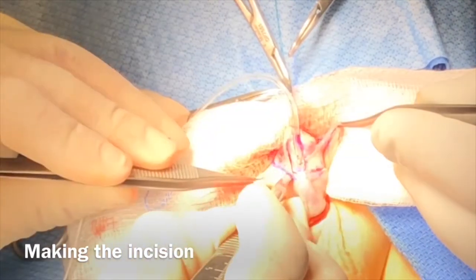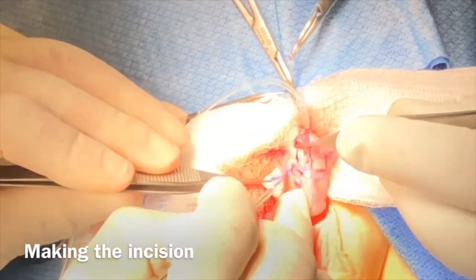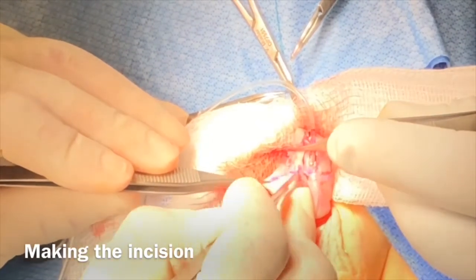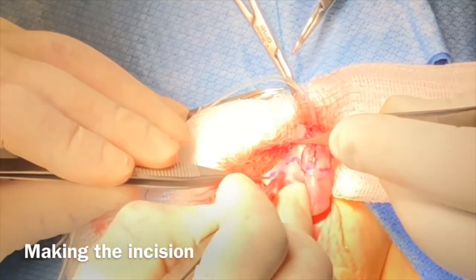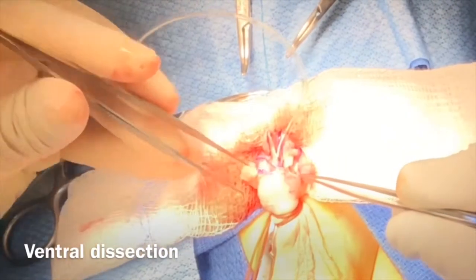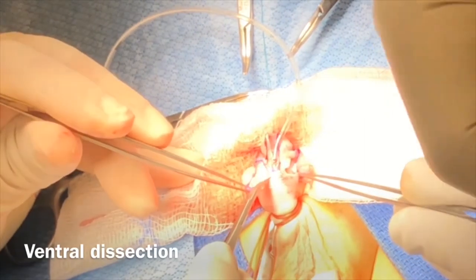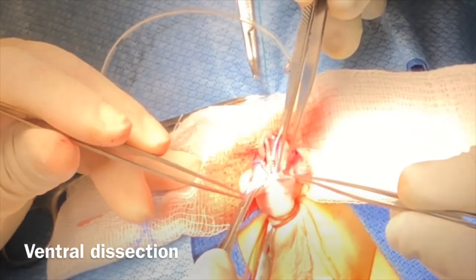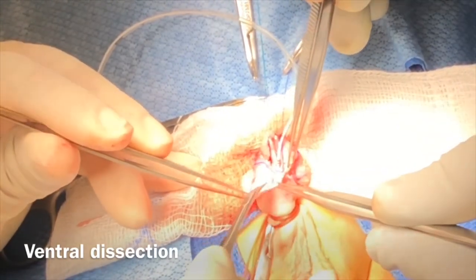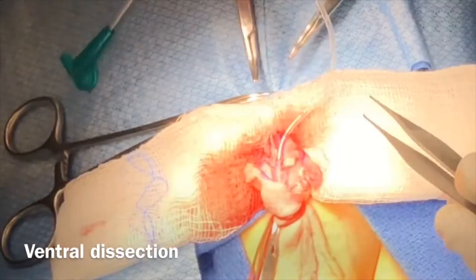It is very important to follow the traction and counter-traction for precise incision and mobilization of the glans, urethral plate, and ventral skin, using the sharp eye knife or iris scissors.